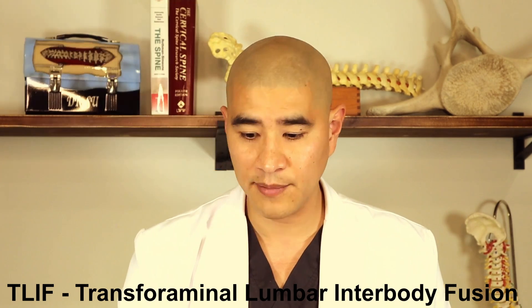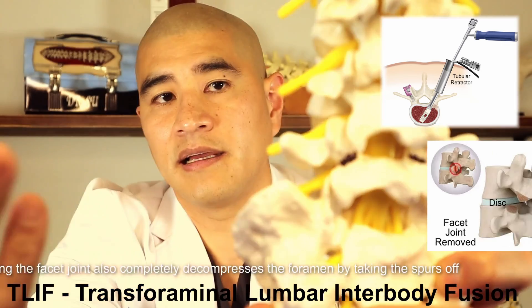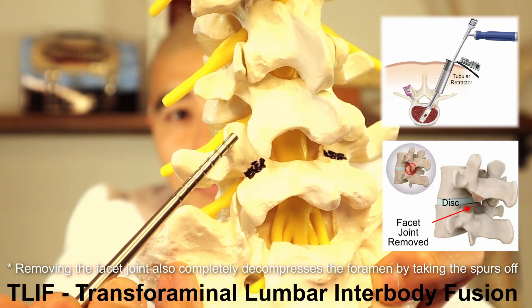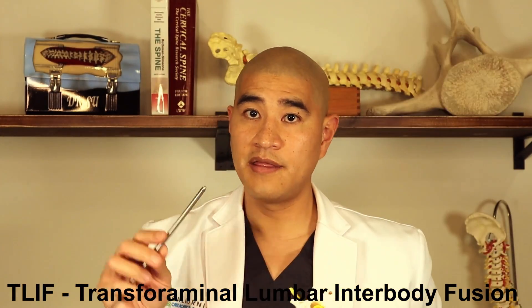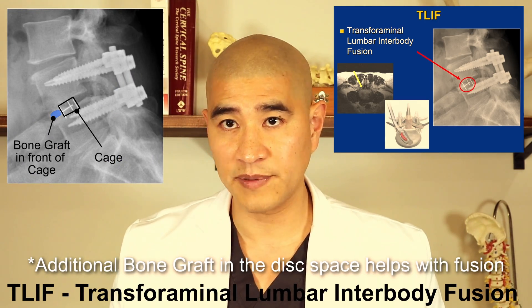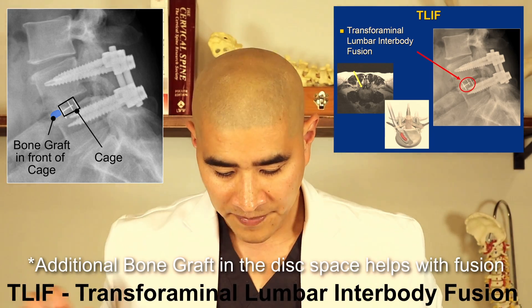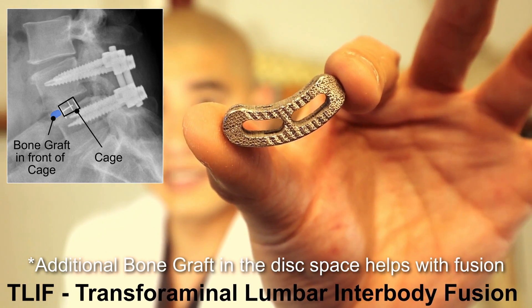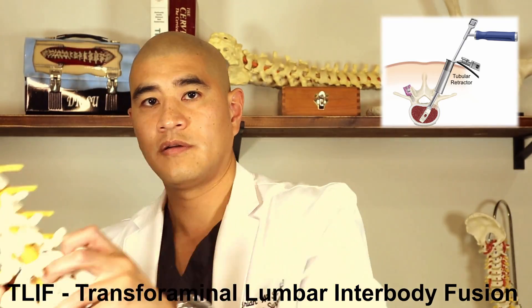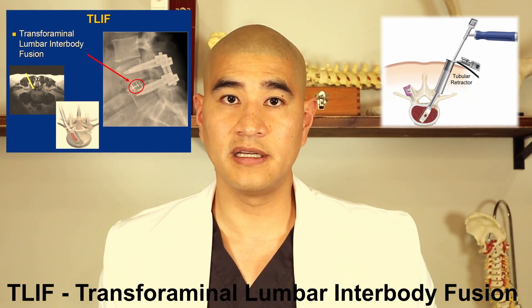The next approach is the TLIF, which is probably the most common approach for lumbar fusion today — the transforaminal lumbar interbody fusion. This involves going from the back and removing the facet joint. Once you remove the facet joint, you can easily access the disc, take it out, and put a cage in. The cage used for a TLIF is the smallest of the three cages because you have to negotiate around nerves in the back without being able to use a large cage. Here's what a TLIF cage looks like — it's smaller but still has a hole where you can put bone graft. The cage is inserted from the back into the disc space.